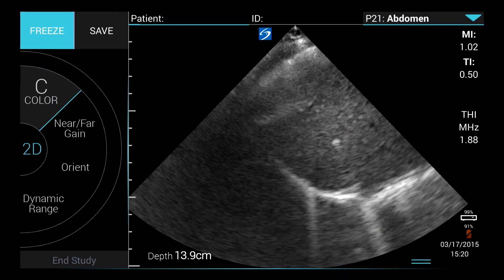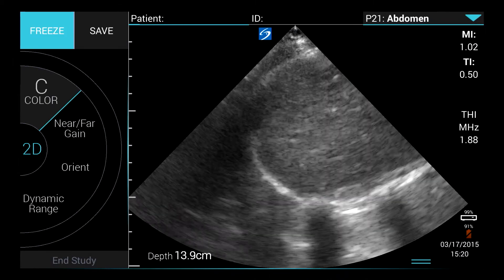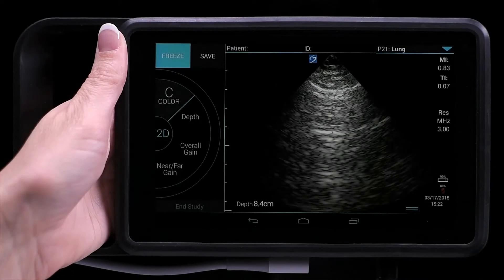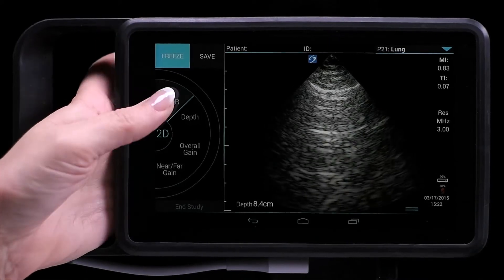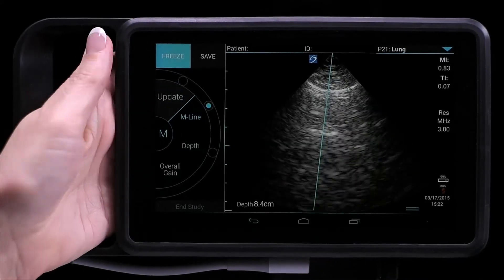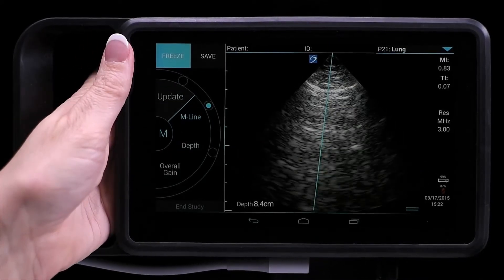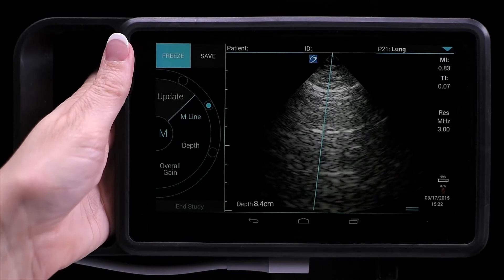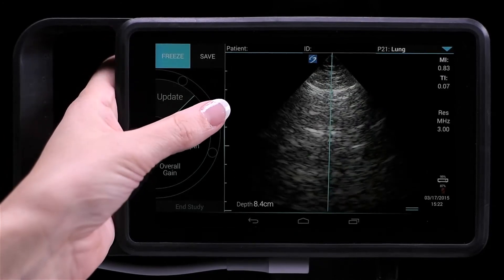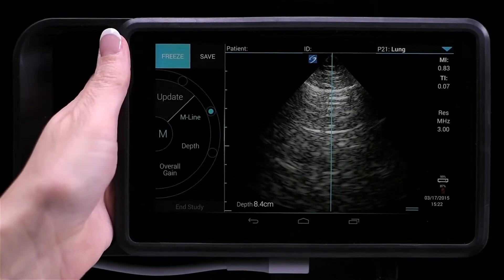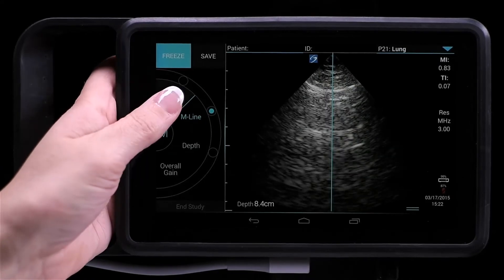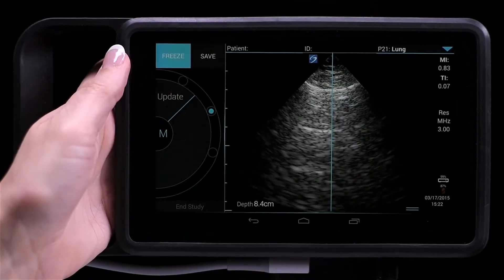2D is the default scan mode. To change to M mode, press and hold the 2D button on the control wheel. Slide the M line to the desired spot on the screen, and then tap Update to activate.